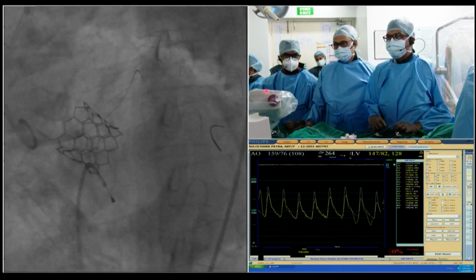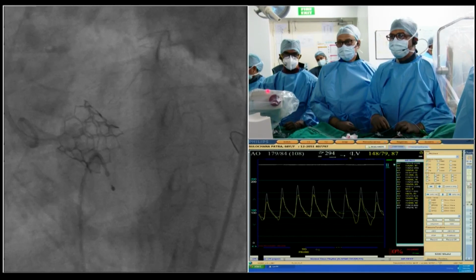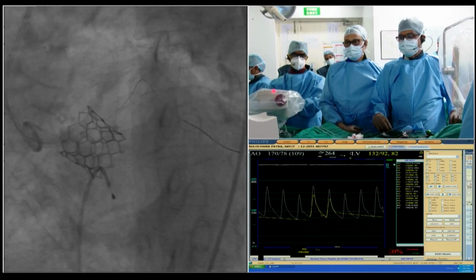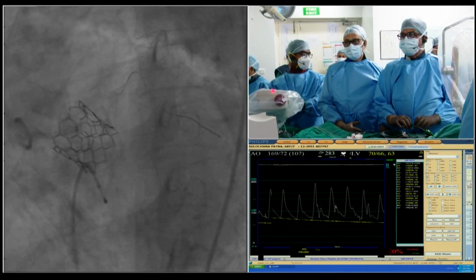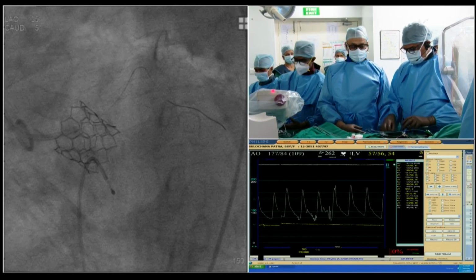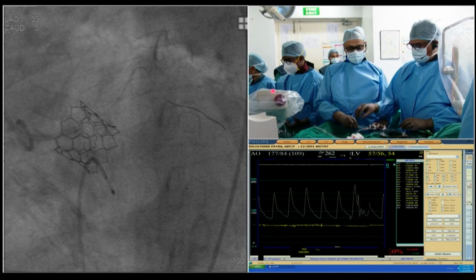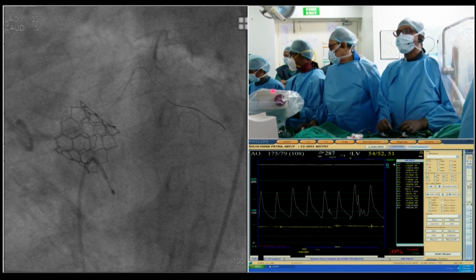So I think we stented the left main, but I don't think that the left main is coming out into the annular area. Unfortunately, it moved forward a little bit. So, yeah, what do you think? Dr. Rath is saying, should we put one more? Yeah. Right. Yeah, give us a short 4.5 or 5.0 or something, please. 4.5, 8.